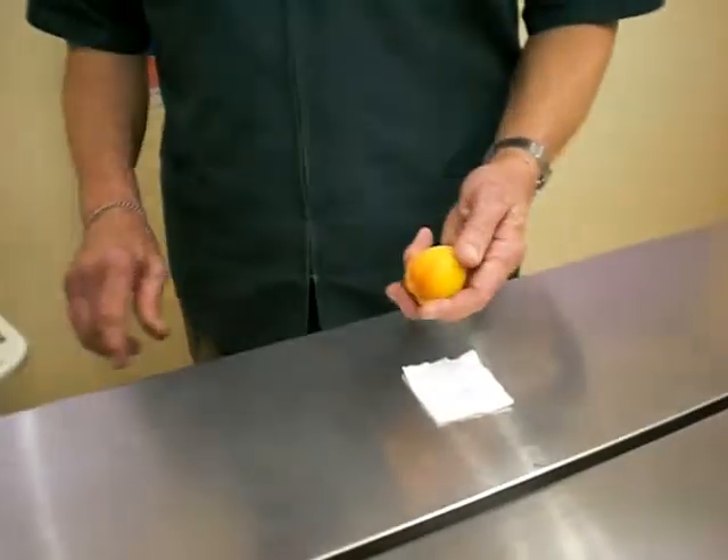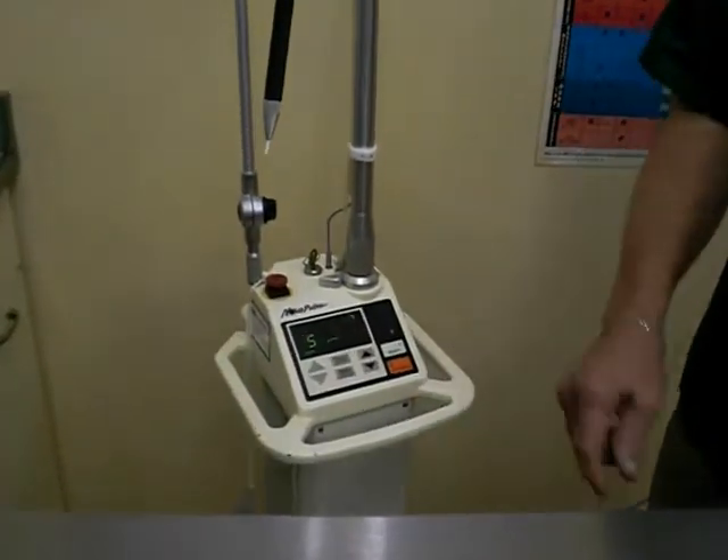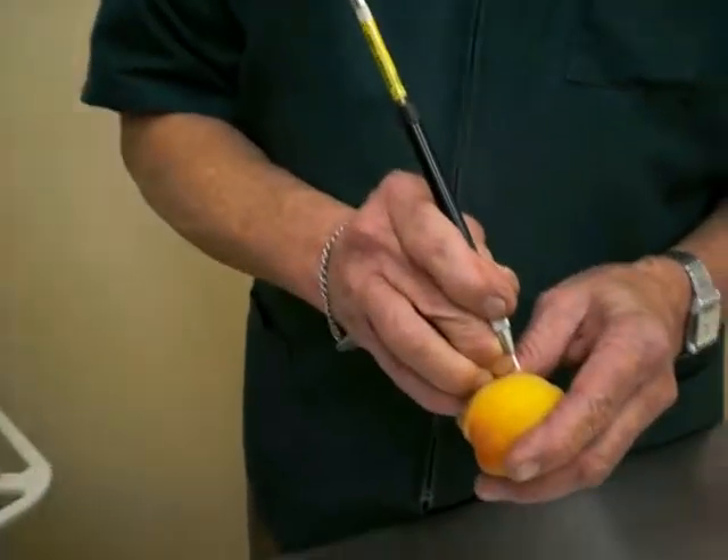Now we use the laser and I'm going to use an apricot here to demonstrate what we do. I'll put my settings in here and then there's a foot pedal that activates it. And so now I'm going to just show you what this is.